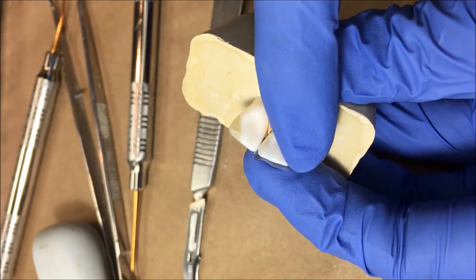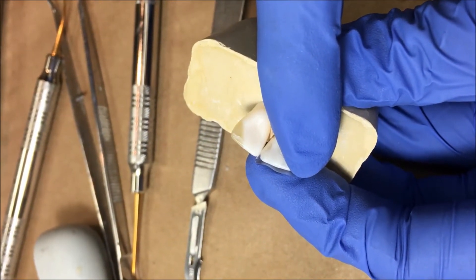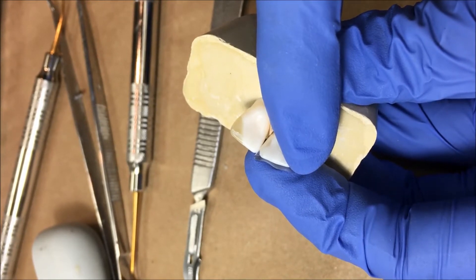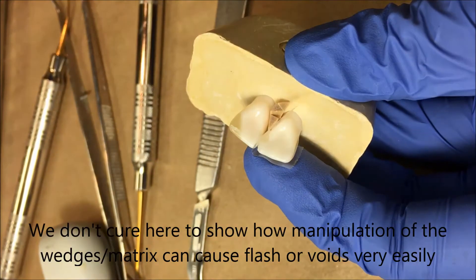But recall and remember I have not moved my finger on the facial at all. So this is the point where I would cure which we don't have a curing light. So let's pretend I've cured that.